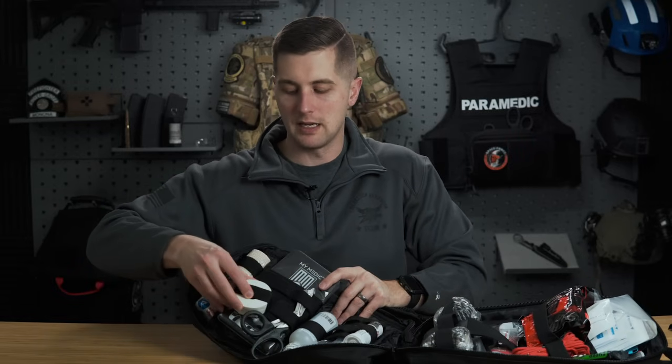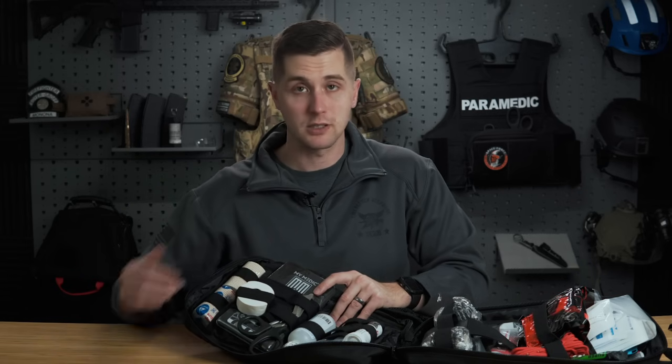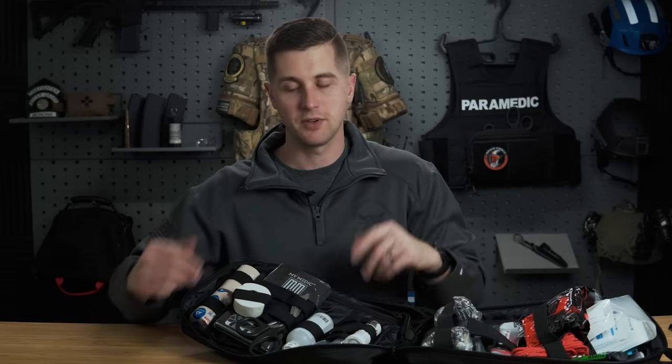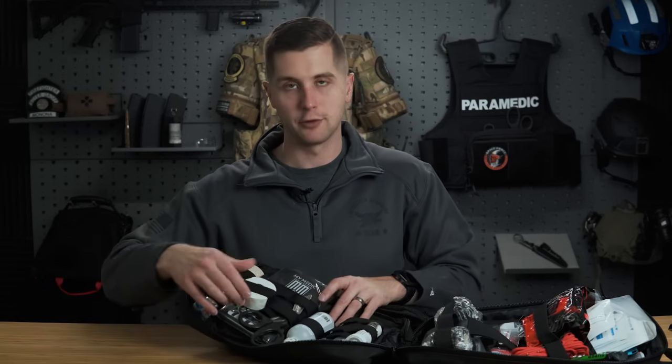Then you have a thing of tape. Just tape, super useful. You can use it to secure the splint if you want, use it to tape fingers together, or use it to fix pieces of equipment. Great thing to have. Highly recommend it.